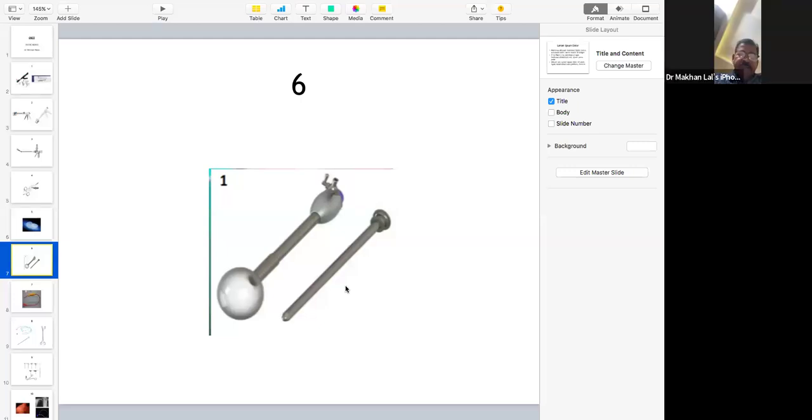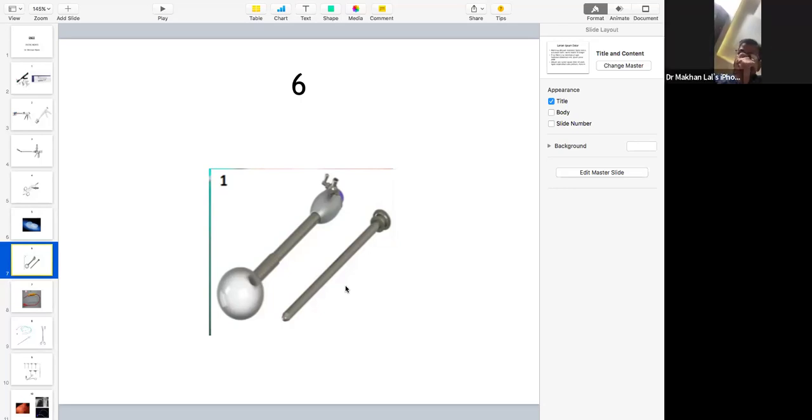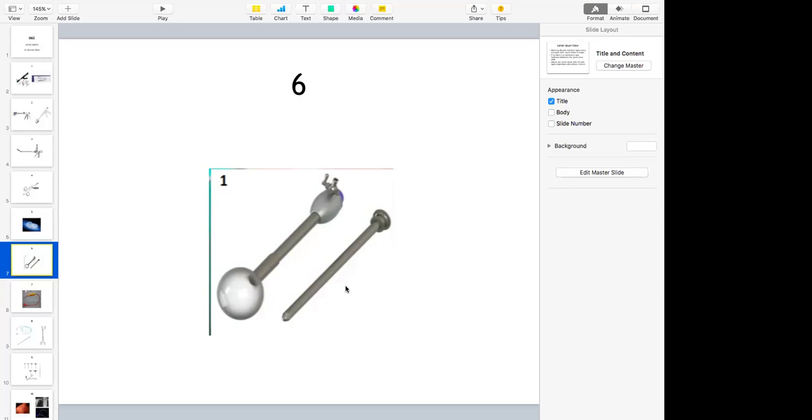You have a number of surgeries, 4, 5, 6 surgeries. Can you manage with the ETO? No, sir, it is time consuming. How much time? Sir, 12 hours. Whereas plasma does it much faster.